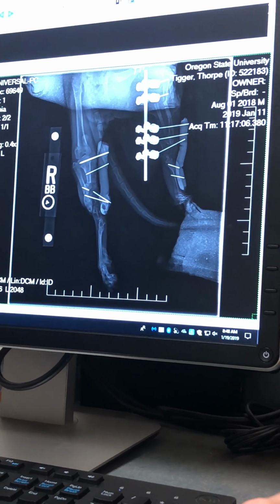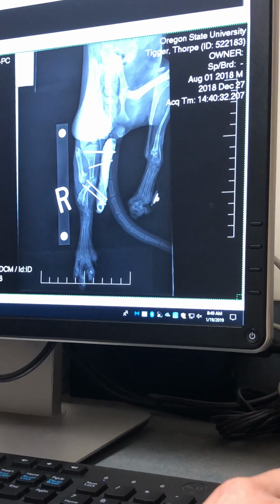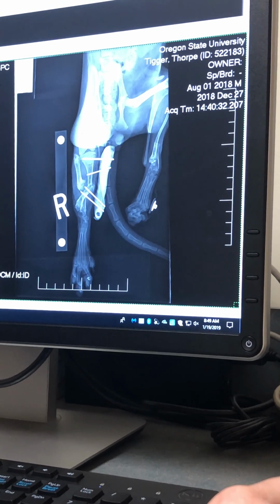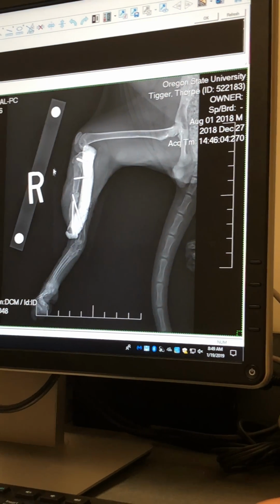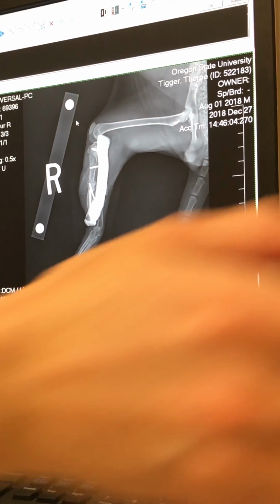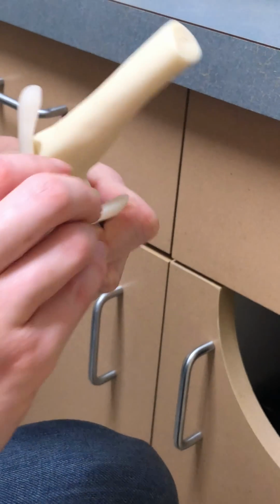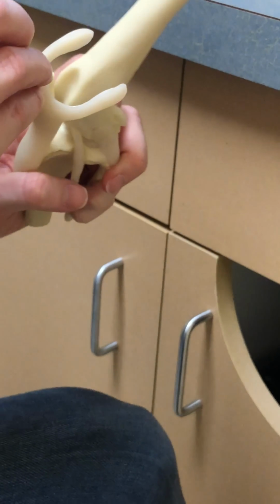One second. It's kind of going way back in time here. So initially, it's a little hard to see, but his little kneecap is a circle right here. And part of what we did was try to put his kneecap back in line because it wasn't in line. You can see it better here. There's a little kneecap on the side. And basically in the knee, there's a divot, which let me see if I can find one. So in the knee joint itself, there's usually a little divot, like boop, and then the kneecap sits right in there. And when it's out of line, the whole knee is not in proper alignment. And so his kneecap before surgery was way out here. So we went in and made a better groove and put it to sit in there.